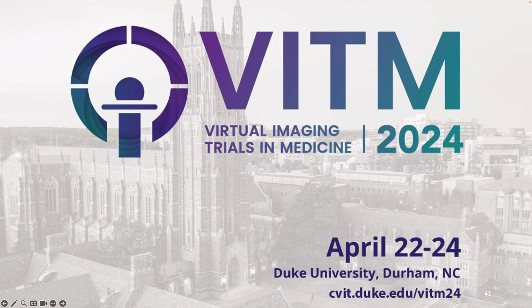Let's say you are modeling lung lesions, and the purpose of the study is that you want to understand the effects of radiomics in CT images and the effects of imaging parameters on accuracy of radiomics. So in that, you need to look at literature and understand the diversity of the lesion sizes. So if we have lesion sizes from 1 millimeter, 2 millimeter to 15 millimeter, and that's something that is documented, you want to make sure that you have that distribution.